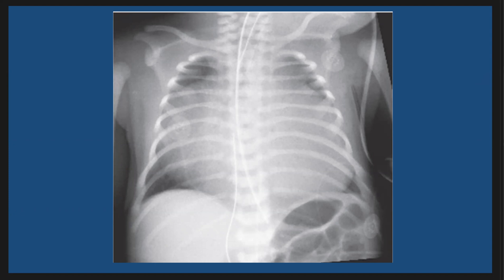This is a new case discussion. As we see here, this is a chest x-ray for a neonate with severe cyanosis. This frontal chest x-ray shows massive cardiomegaly with a box-like appearance and convexity of the right border of the heart. We also see that the pulmonary vascularity is diminished.